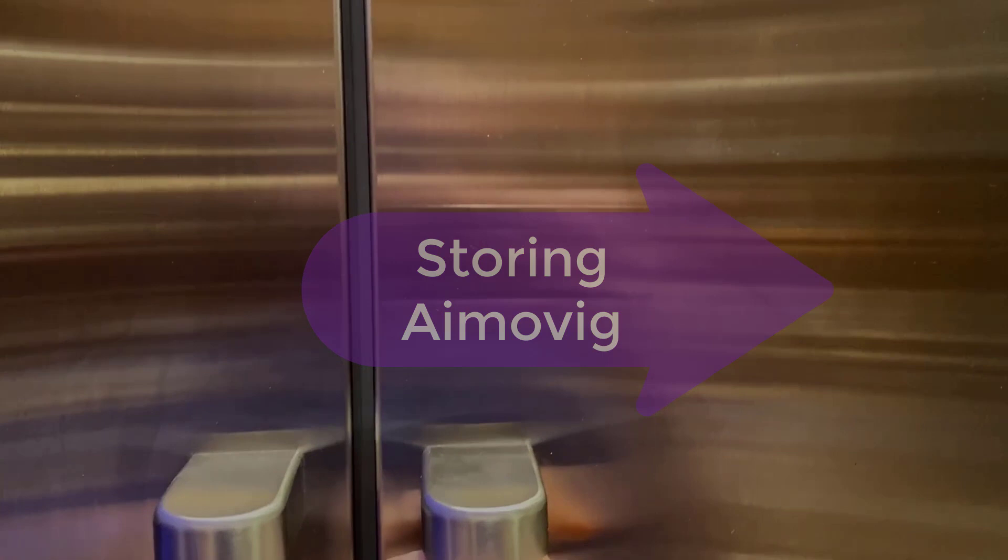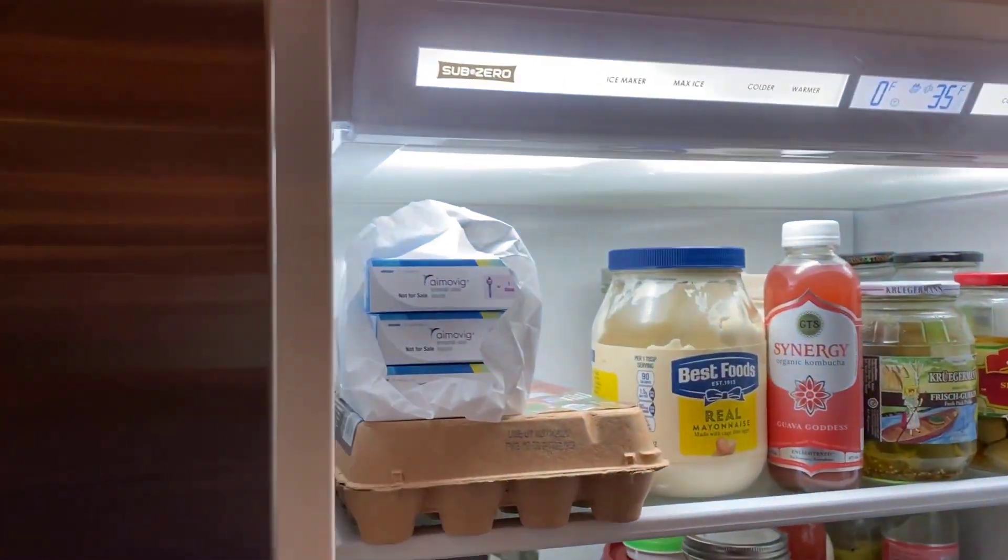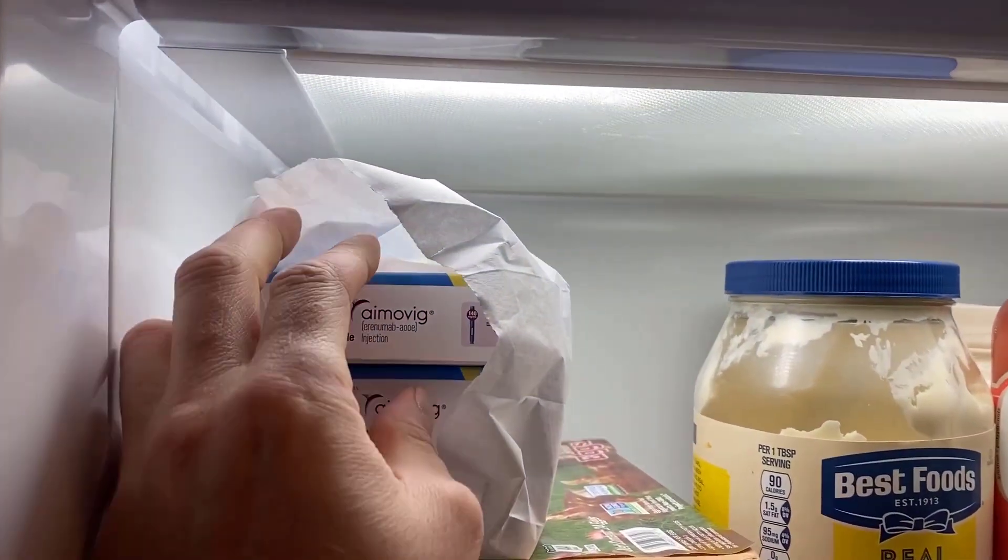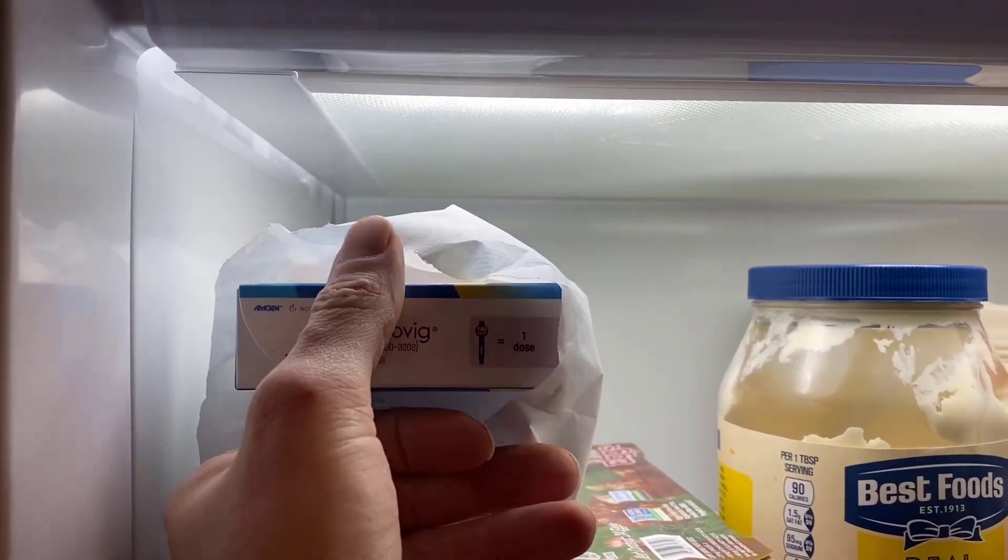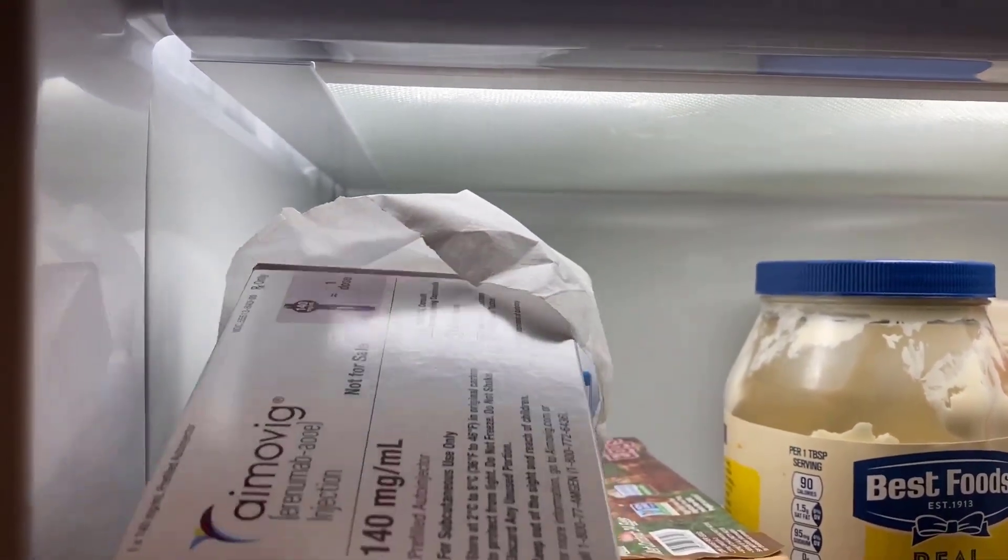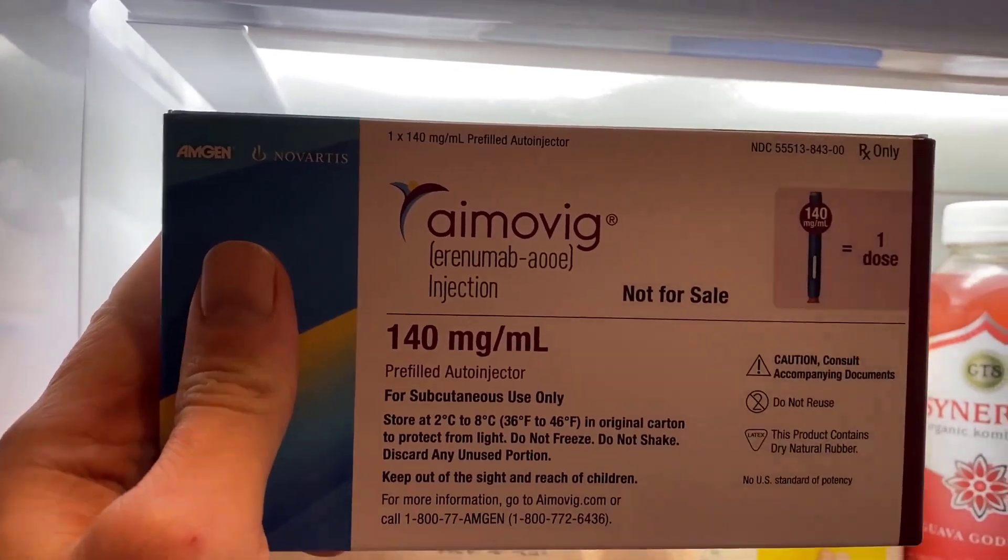Remember to store Amovig in the fridge. You can leave it unrefrigerated for up to seven days, but if you haven't used it within seven days and it's been at room temperature, you have to throw it away. Keep it in its original container, don't freeze it, and don't shake it.